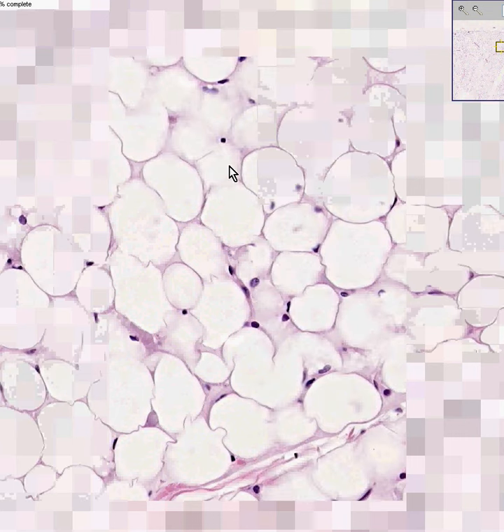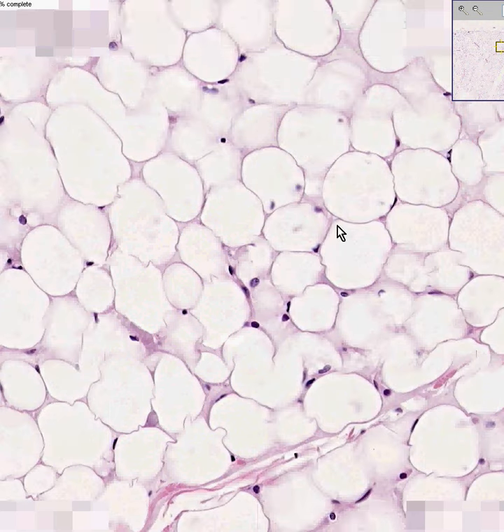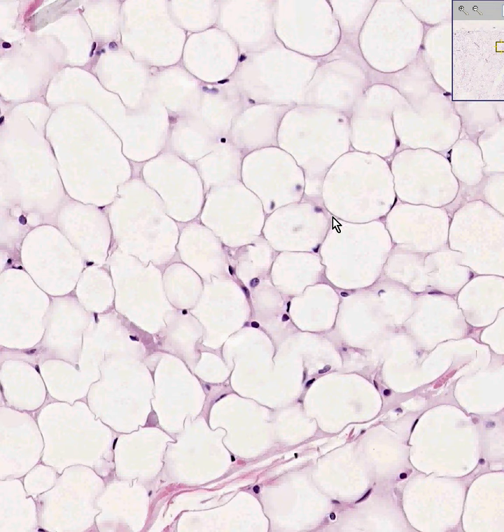Because of that, the nuclei of these adipocytes are classically a little bit spindly and pushed off towards the side, and sometimes you'll be lucky enough to see little blood vessels or little capillaries, like perhaps here, like certainly here, in which you can see the blood traveling within the septae as well.